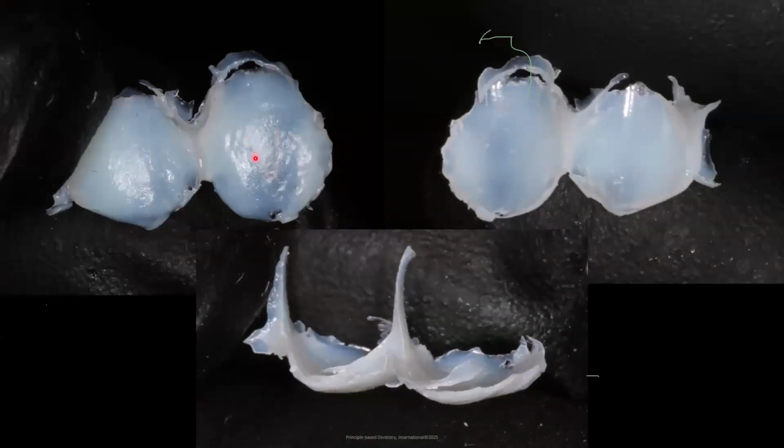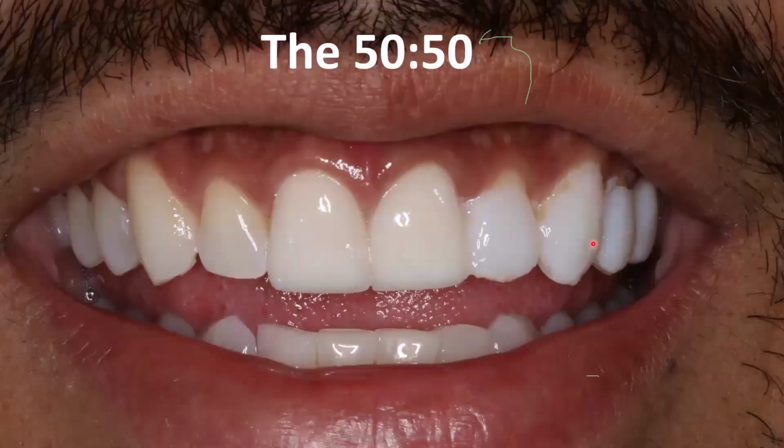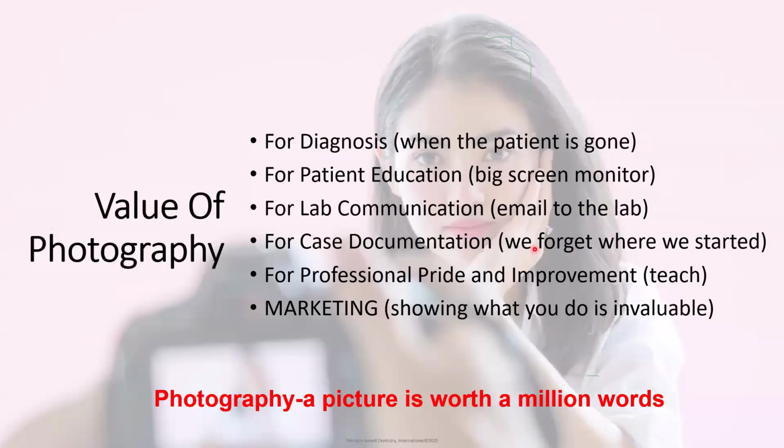I peel those off. I want to see how thick I made that wax, and you can see that I made them fairly thin. Then we do the 50-50, where we take off the acrylic overlay from 8 back. And so from 9 back, you can see the acrylic, the color change, and just a little bit of the shape change. So we do our photography.